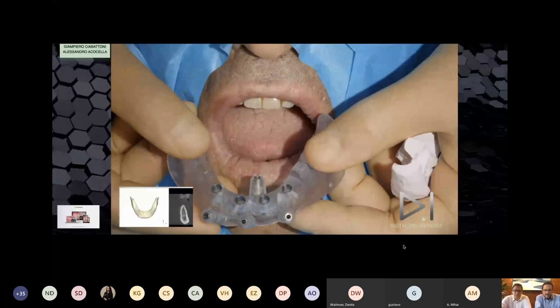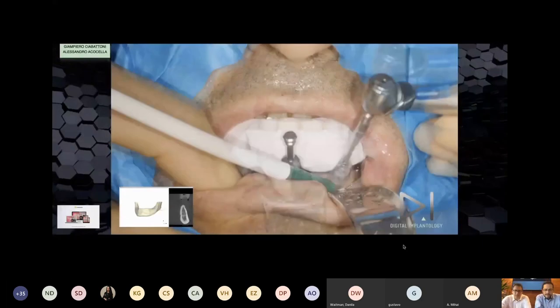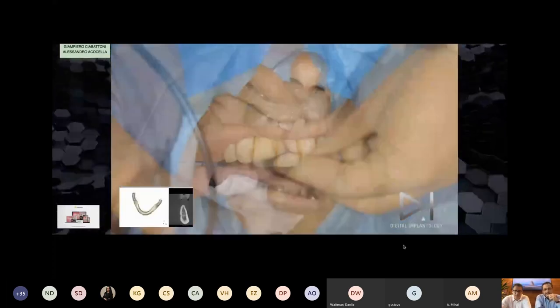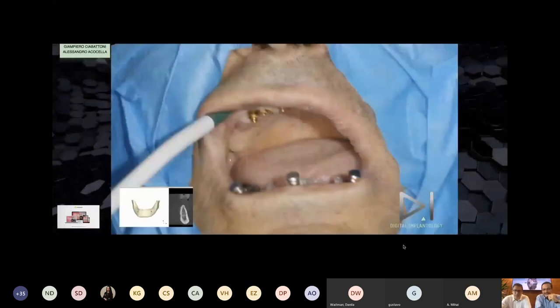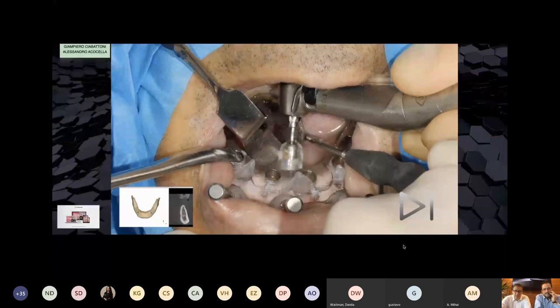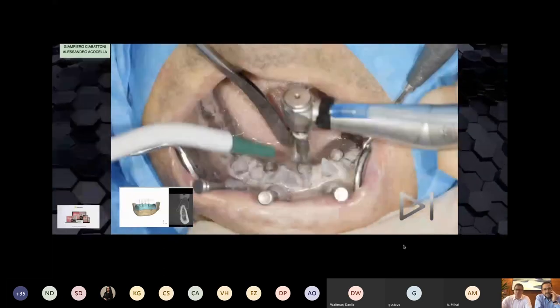And so these are the steps during the Alpha Bio course: surgical index as usual, fixation, the pin, pre-buccal pin. We also remove the prosthesis that was not yet integrated. Anyway, we have to recover the space for handling the tools in the lingual because we have to place this lingual pin, very important. Then we start with the drilling protocol, 2mm drill from the Alpha Bio GSDK kit. Very, very fast surgery.